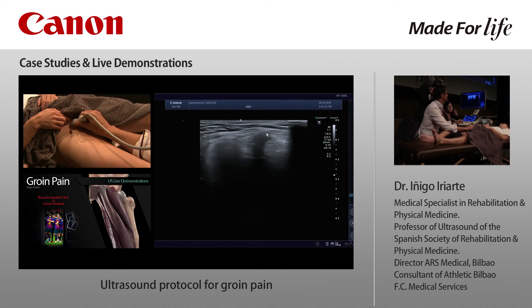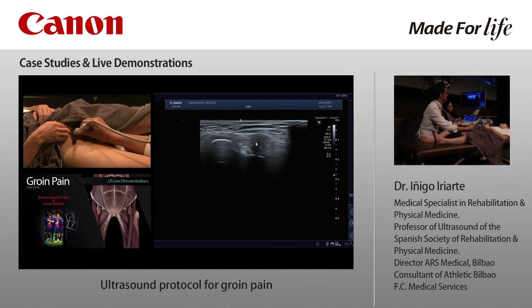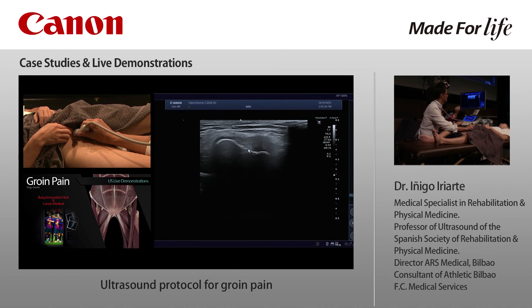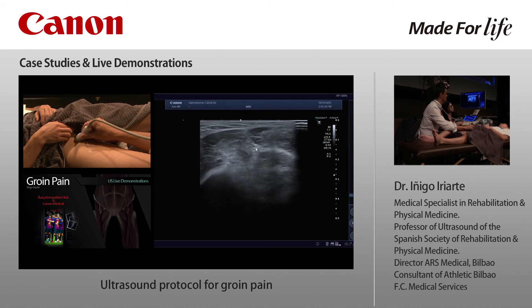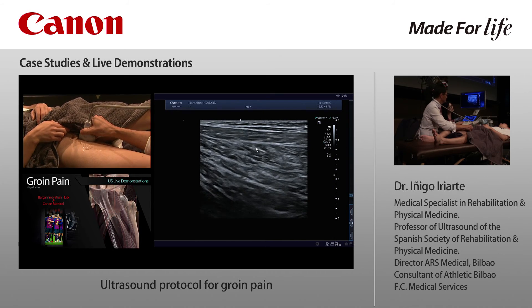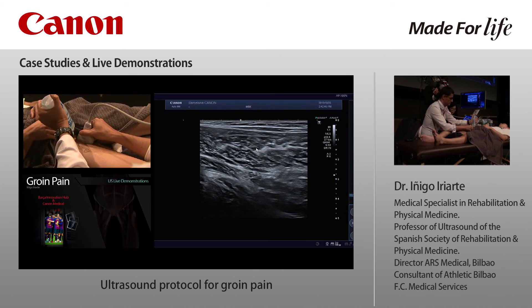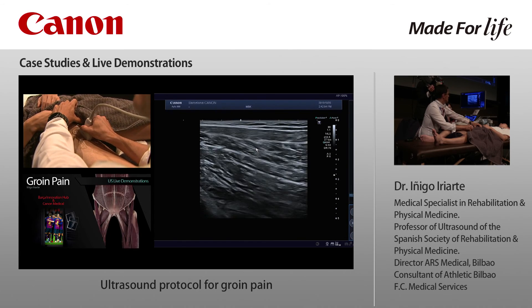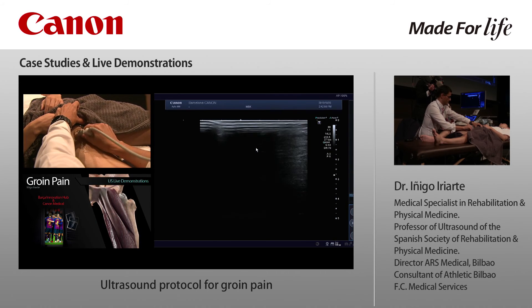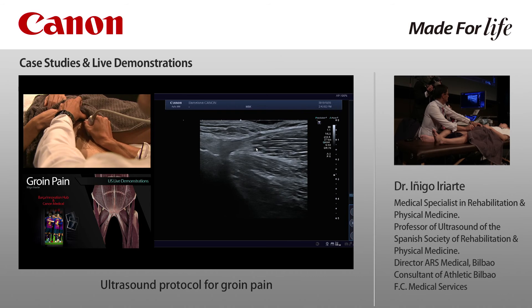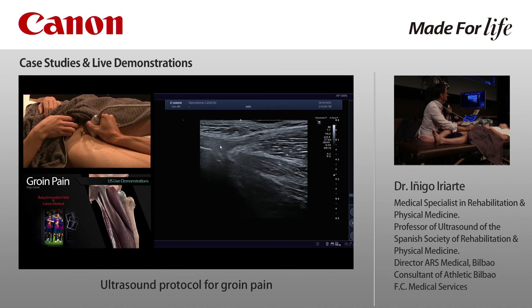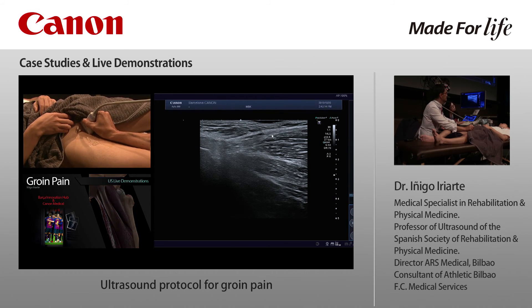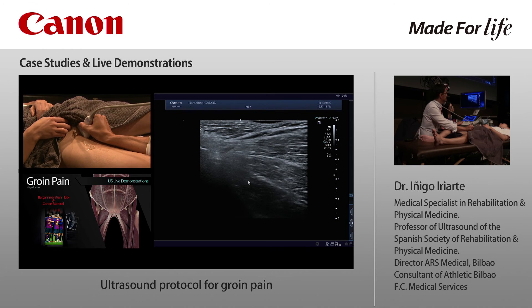You can see the insertion of the adductor longus in short axis in the pubis, with a small irregularity in the bone. This is the insertion of the adductor longus. We rotate the probe 90 degrees and go on the long axis. This is the insertion of the adductor longus tendon in the pubis. This layer is the adductor longus, this is the adductor brevis, and this is the adductor magnus.